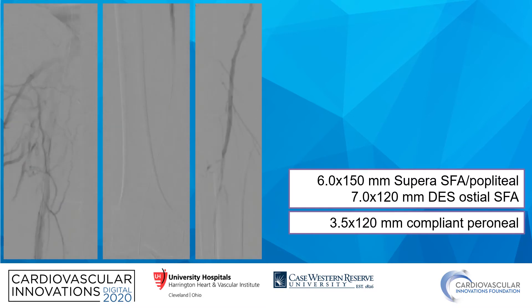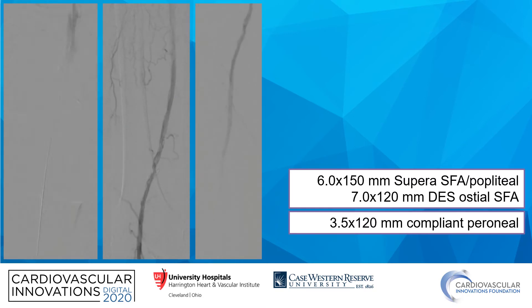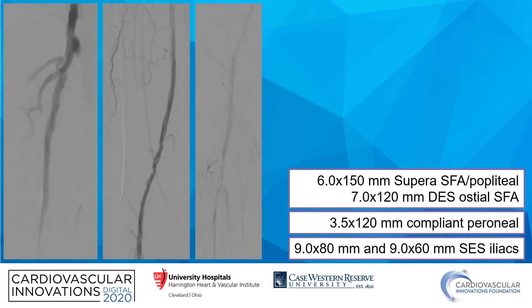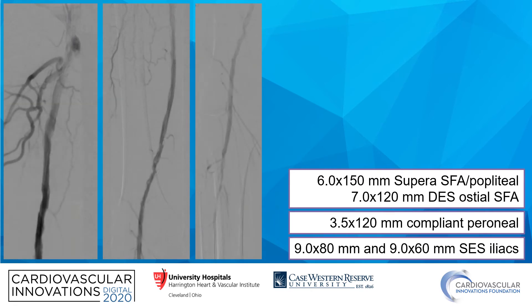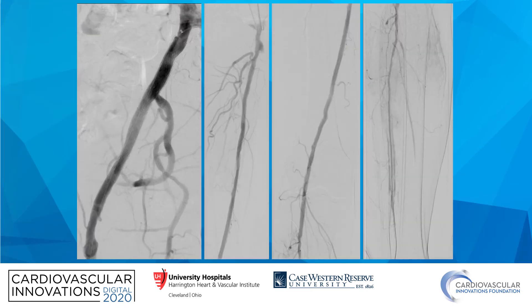We performed angioplasty of the peroneal artery. Concomitantly, we were able to remove the retrograde sheath with angioplasty for hemostasis. We then performed two self-expanding stents into the iliac arteries — into the external and common iliac arteries. Here are our completion angiograms. As you can see, the iliacs are widely patent. The ostium of the SFA is covered with some mild protrusion into the common femoral artery to secure the inflow. The popliteal distal SFA Supera stent is nicely expanded and we have good runoff into the peroneal artery.